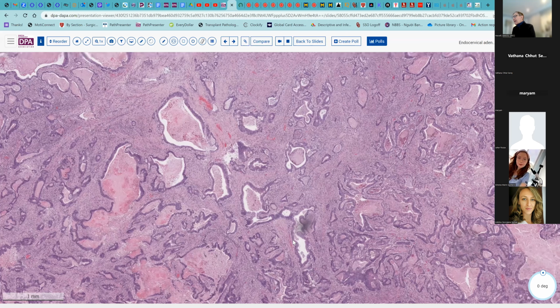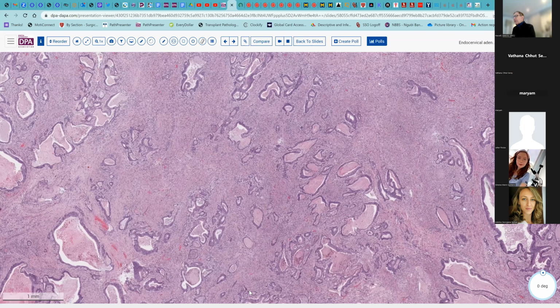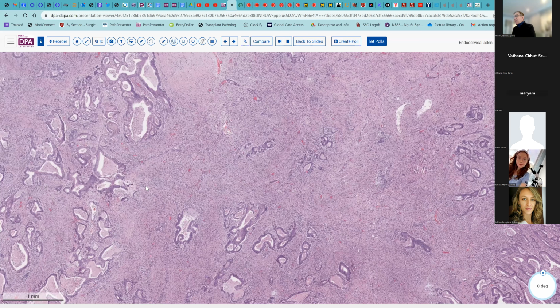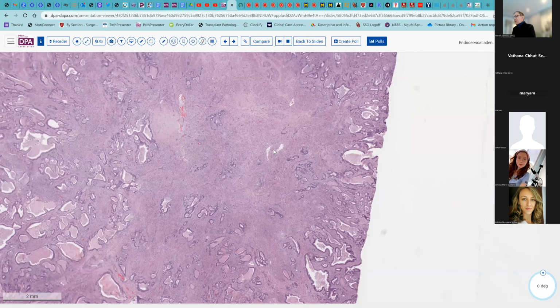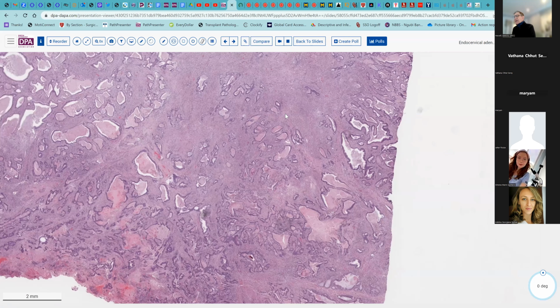And this illustrates nicely the fact that these tumors are very deeply invasive. They're high-risk tumors. The survival and the treatment results from these tumors is not very good. But they can be confused with endometrial tumors. And of course, they do not respond to the conventional treatment with endometrial tumors.